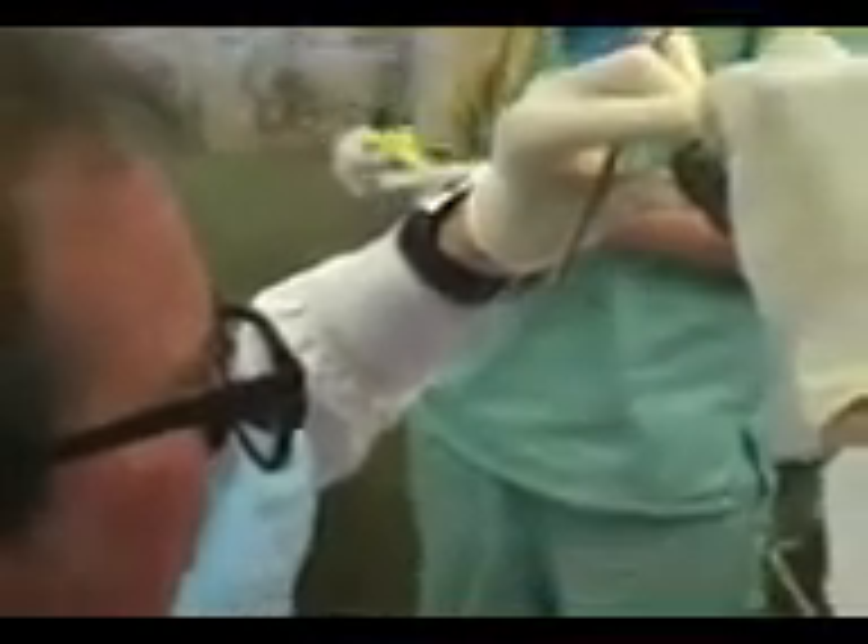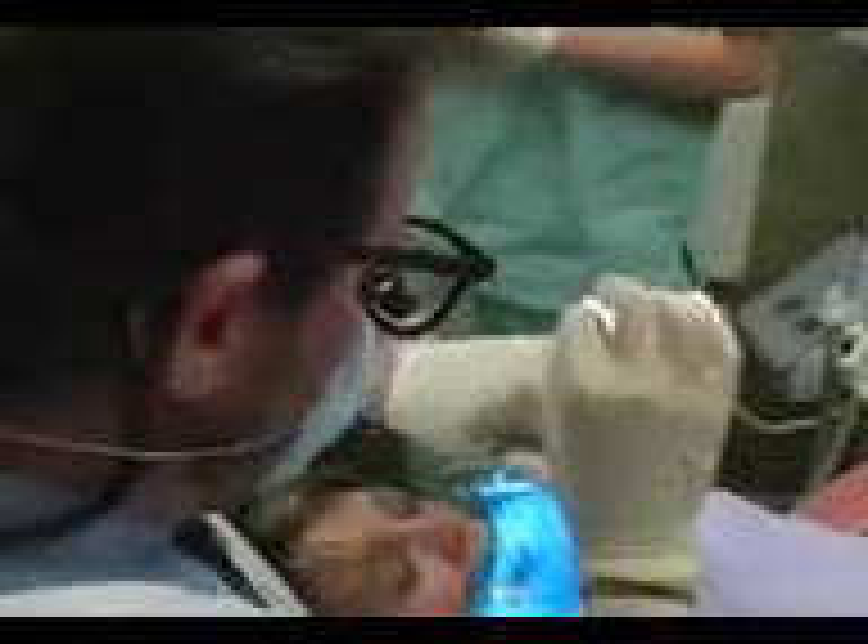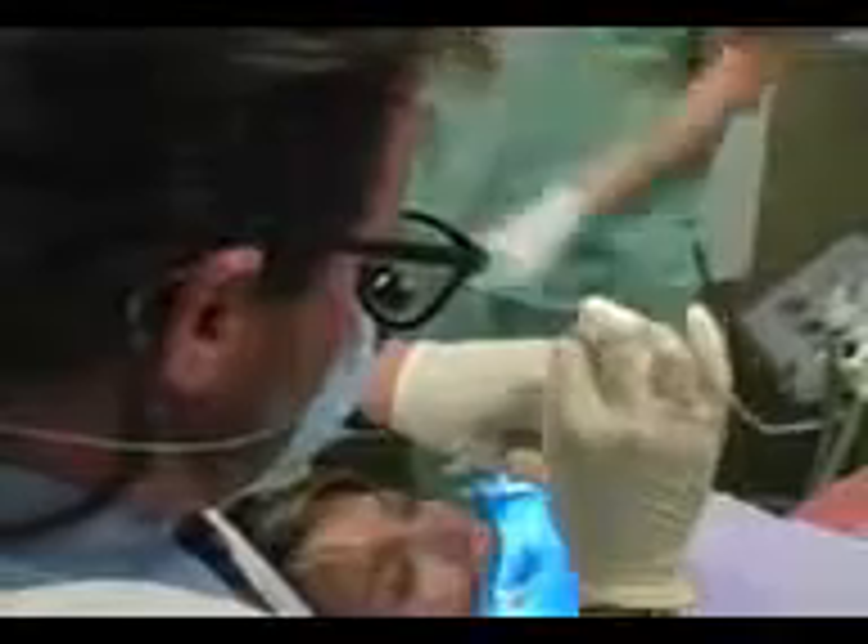I like to use the X-ray to give me one approximation of how long the tooth roots are, but we also use a machine called an apex locator to help us as well. We're measuring the tooth roots now — this is the apex locator and we're clipping it on.